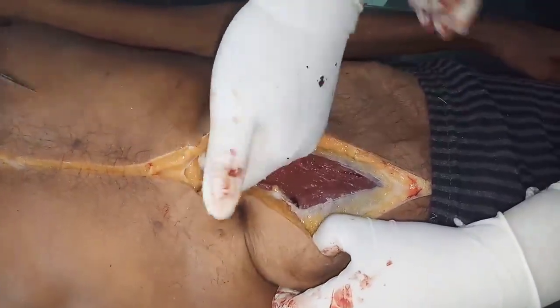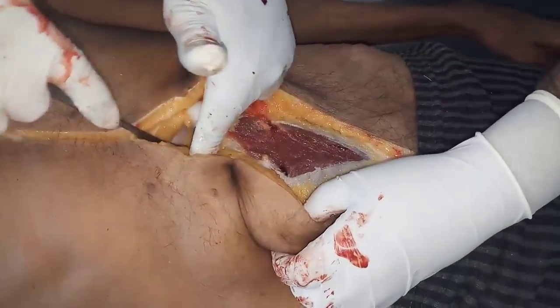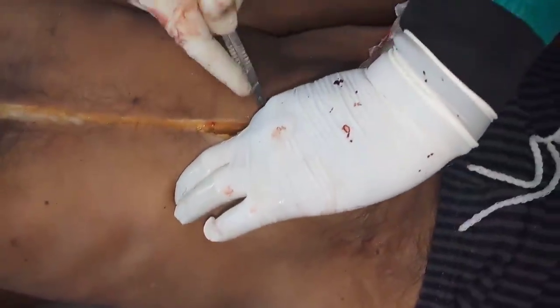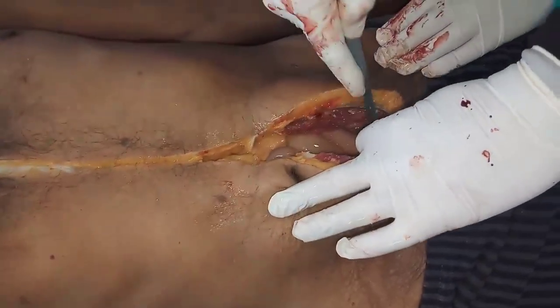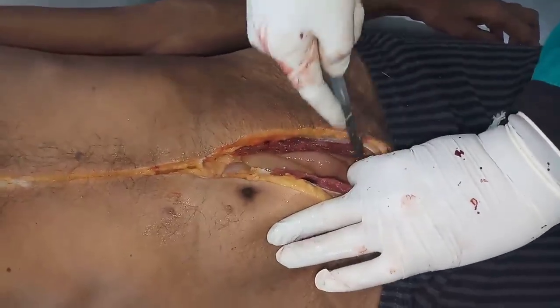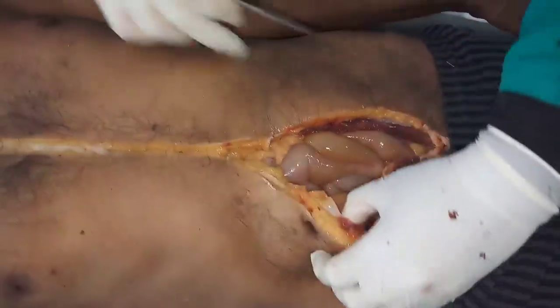Now I am going to put two fingers in the peritoneal cavity. Now a little smell will come because the peritoneum has opened. So now this peritoneum is cut. So you can see the intestines.